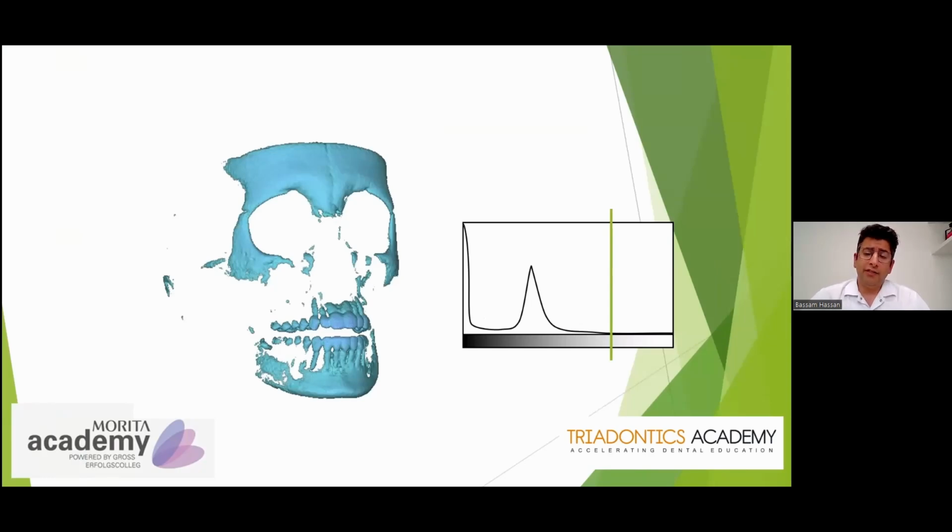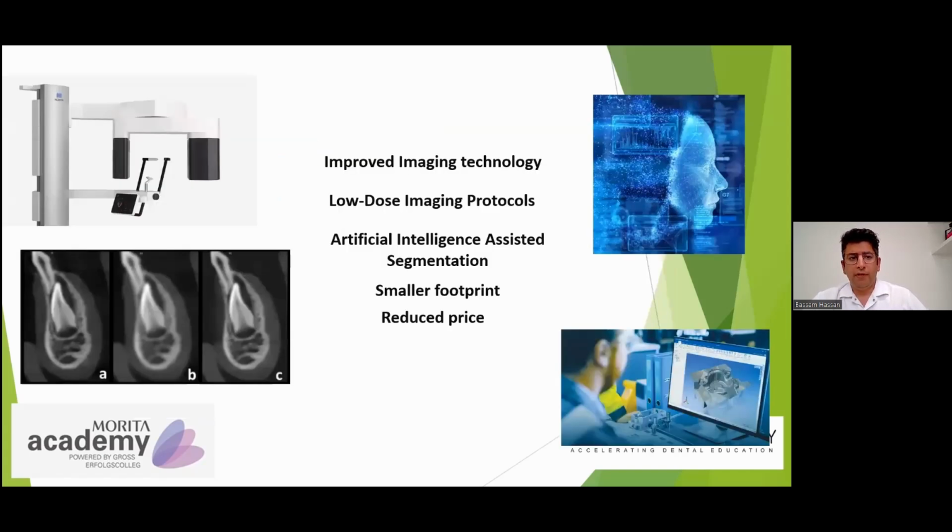And unlike intraoral scanning, in which there have been significant improvements in the hardware in terms of resolution and stitching accuracy, with cone beam we had different advancements. We had improved imaging technology, which means that the sensors became more sensitive to the X-ray. You needed much, much less radiation to achieve a high quality image. And of course, I'm talking about high-end models.